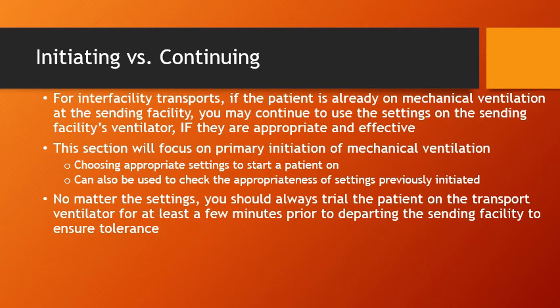They don't all provide breaths the same way. So you must stay at the bedside and trial your patient on your transport ventilator, like I said, for at least a few minutes to make sure that the patient's going to tolerate that. You don't want to be out the door in your ambulance and on your way when you realize that, oh no, this is not going to work. So that is extremely important.